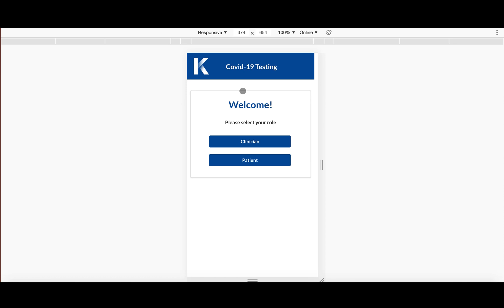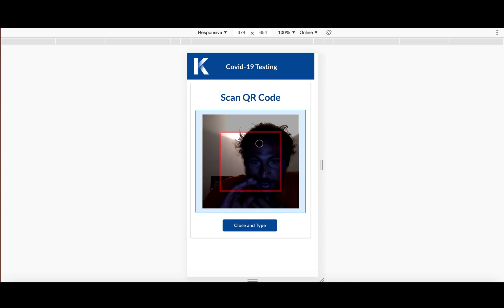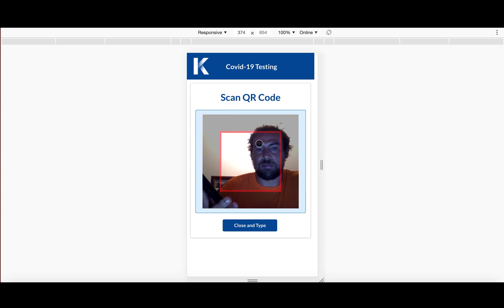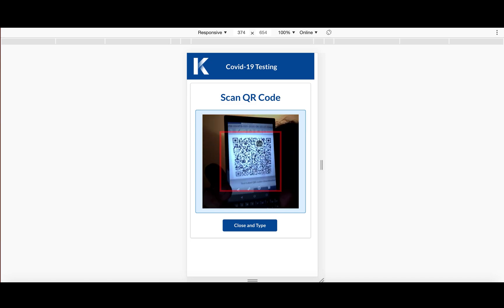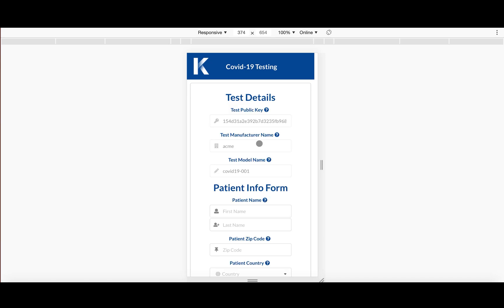So, as mentioned, you're a doctor or a clinician in a clinic or somewhere where you can administer tests. And then you select that you are a clinician and you go here and all you have to do is scan this test label QR code that, as we mentioned, would be on a test. And here, what it shows you is the public key of the test, the manufacturer name that we entered previously in a dashboard, as you saw, and the model name of the test.